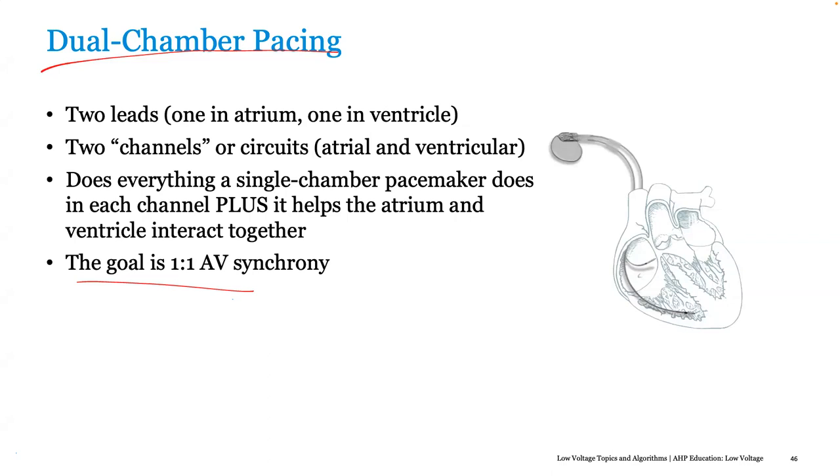Yes, sir. Thank you very much. And given the other population you face down there is your chronic AF patients with slow ventricular response, again, just a very basic VVI pacemaker is suitable for these patients as well. Again, you don't need anything too fancy.